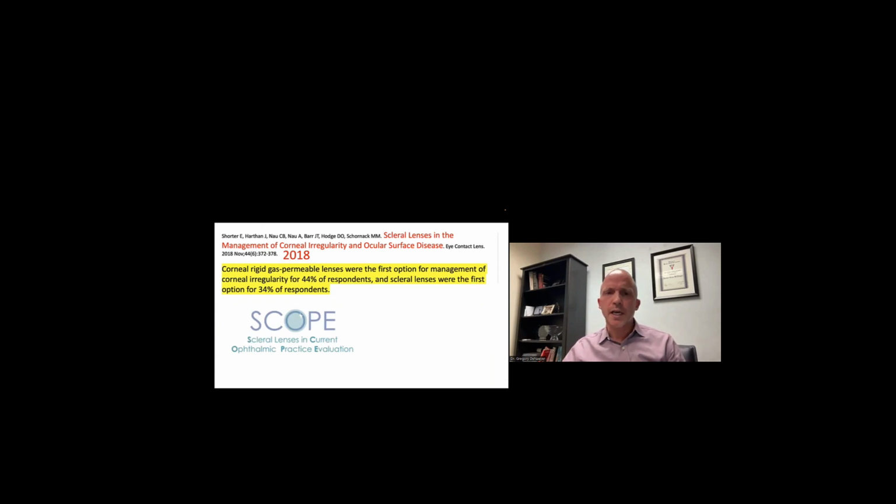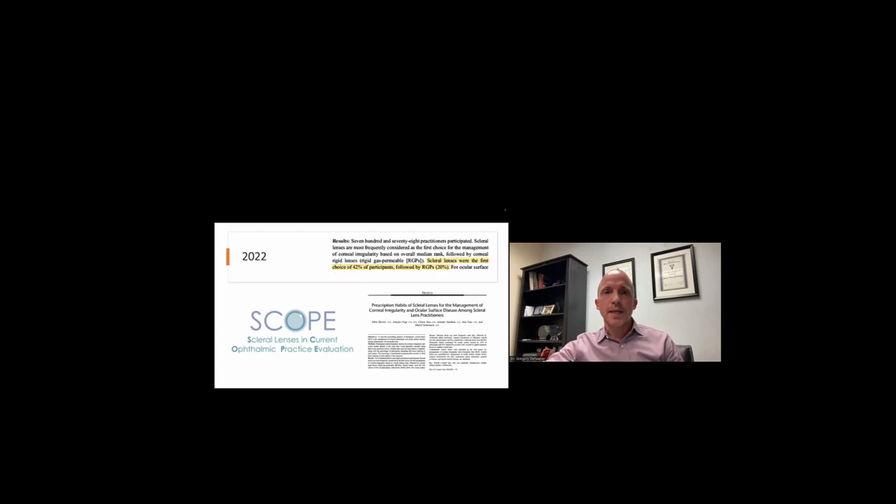Interestingly enough, at that time, 44% of respondents were choosing corneal gas perm contact lenses versus 34% choosing scleral lenses. Well, now the SCOPE team has some updated survey results. Again, this was a survey to over 700 scleral lens fitters, and we see these results have flipped. Now, 42% of the participants said that they were using scleral contact lenses first versus 20% for gas perm lenses.